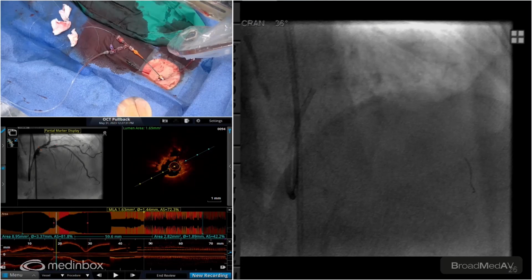That OCT's excellent. Okay, so let's try this 2.0. Okay, let me just move it out there. Good. Yeah, there you go. You got full control. Start in the middle again. Let's see. I'm going to wipe this RotaWire. It's kind of a little bit dirty as we're doing other things. And the RotaWire likes to be really wet. Remember, it's a smaller wire. You have the glide coming your way? Oh, yeah, we got it. There we go. You can just dump it on my hand. Okay, we'll keep this straight for you as much as possible.